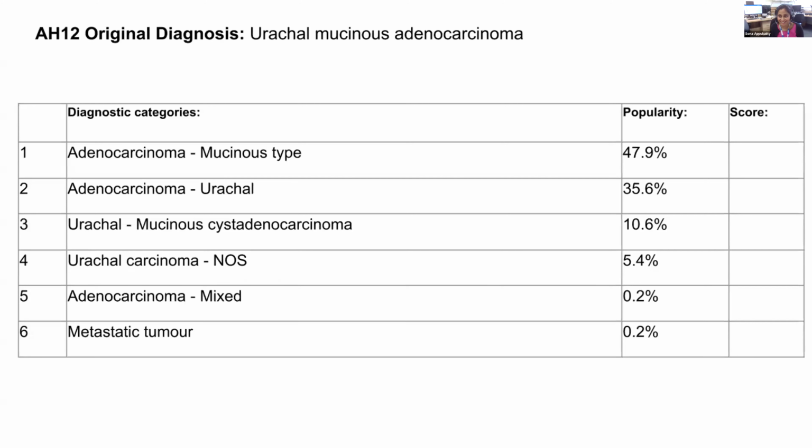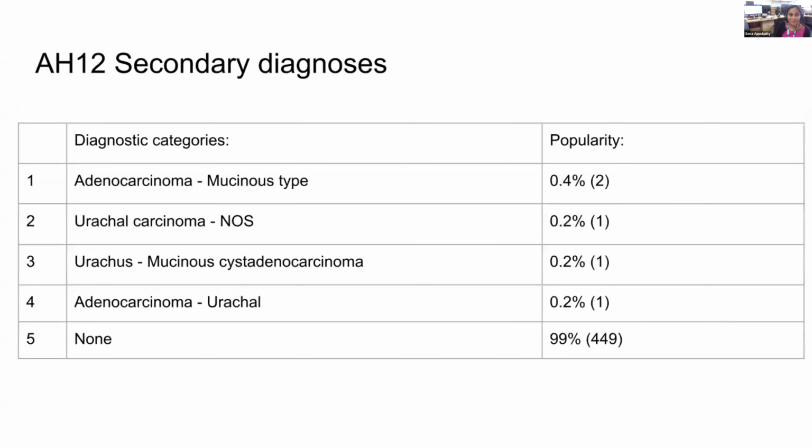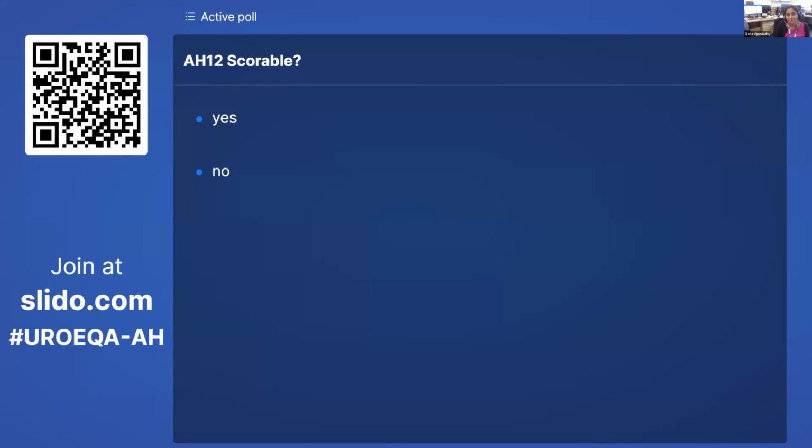Let's see how generous we are feeling, or whether we want to score at all. Yeah, I don't think it was metastatic, but that was one person, wasn't it? Yeah, but well, let's see what the public vote is. Maybe let's see whether it's scoreable first. If you say it's no, then we don't have to worry about scoring. Probably it's all our mistake, this one.